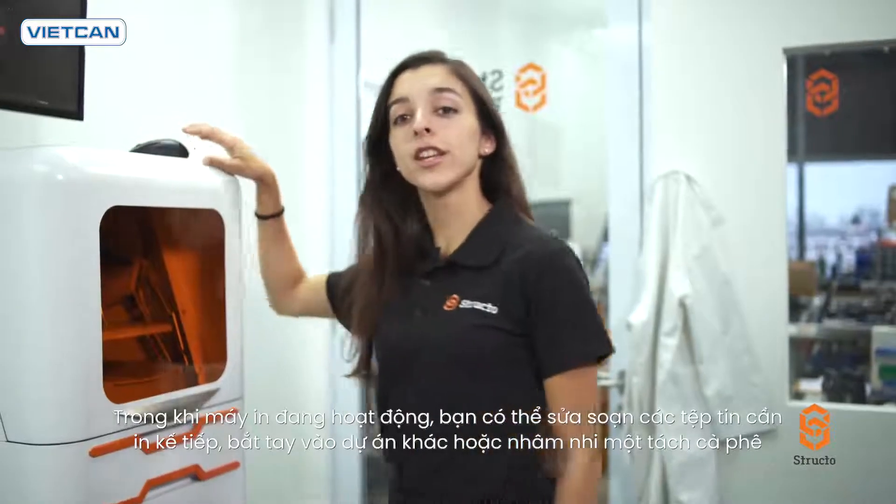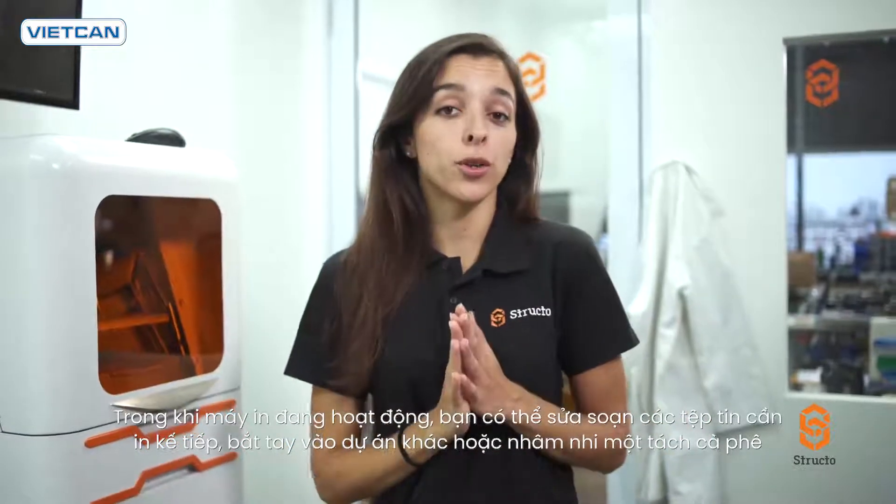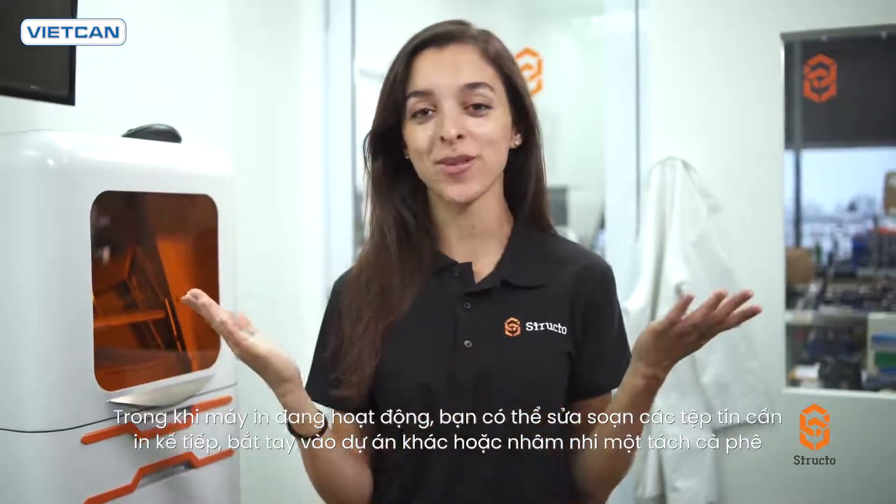While the printer is running, you can prepare the next batch of files for printing, work on another project, or grab a cup of coffee.